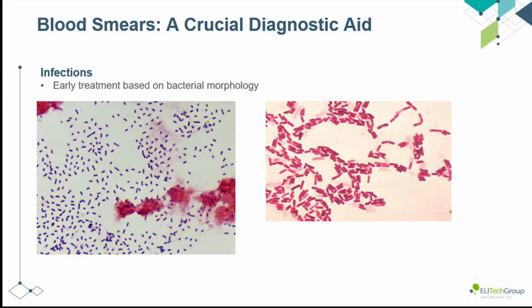Blood smears are a critical diagnostic tool. In just a few minutes, you can provide a clinician with a lot of information that can really change the course of treatment for a patient.